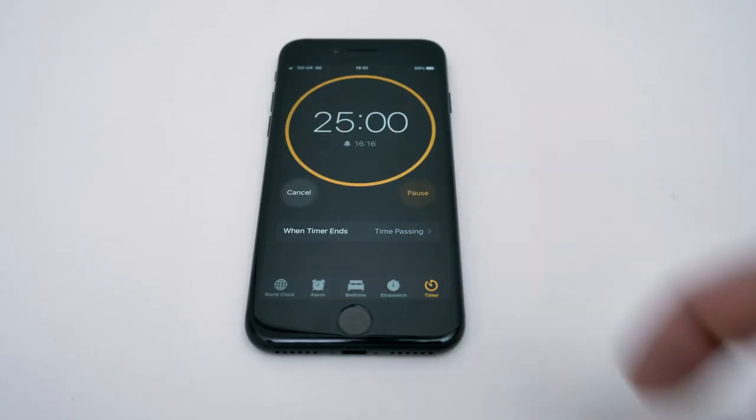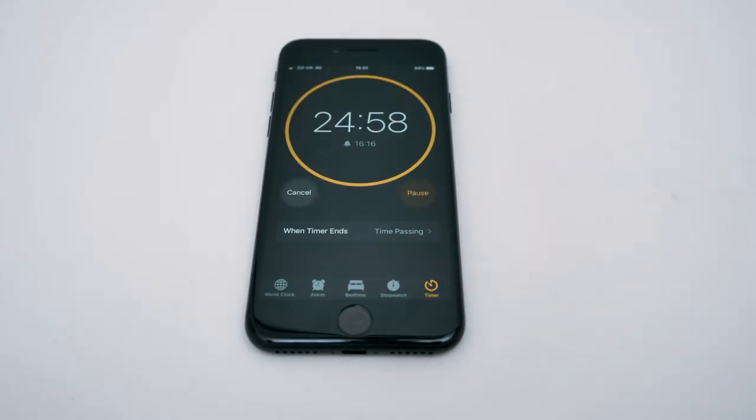At this point, we would start the timer for 25 minutes. We would then let the test run and read the test at 25 minutes. The test can be read in the window between 25 minutes and 30 minutes and should not be read before 25 minutes or after 30 minutes.